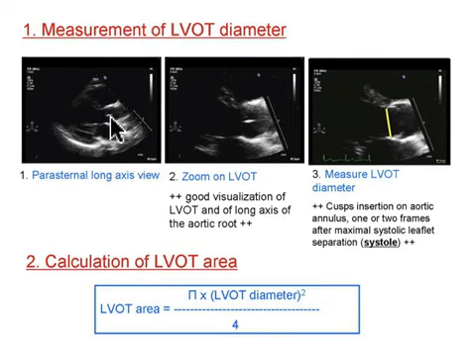And actually right now, I can tell that when this aortic valve's leaflets come together, they have that little white line at the tip of my arrow. You can see that little white line. That's the leaflets that came together. And so that's during diastole, the heart's filling, and those leaflets are together.